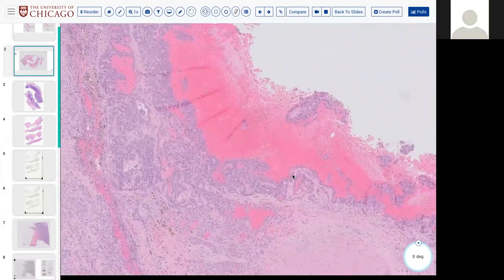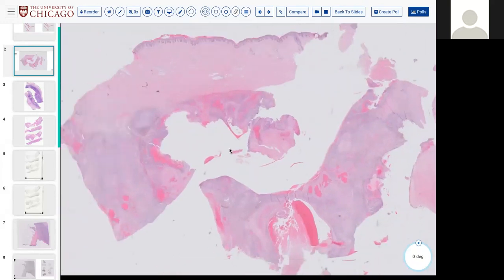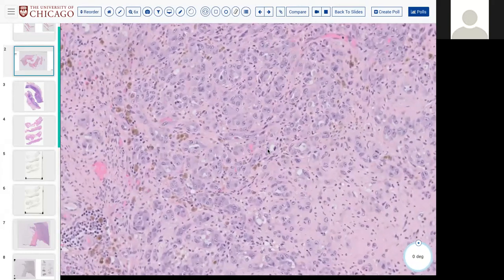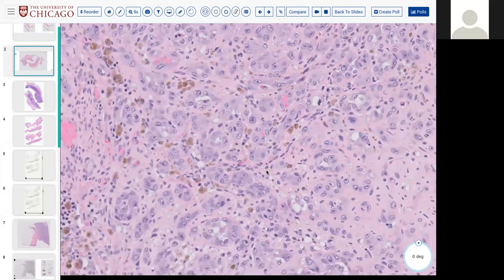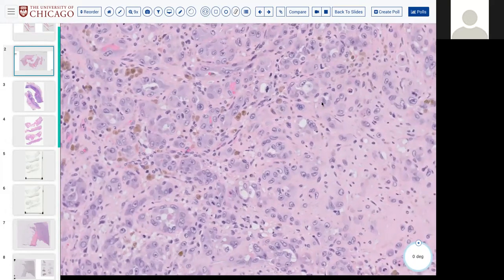So first of all, I'm not able to know if it's epithelioid, is it malignant? It's different than the previous slide, which is what we call epithelioid hemangioendothelioma. Right. So this one, is this epithelioid hemangioma, or carcinoma, sarcoma?